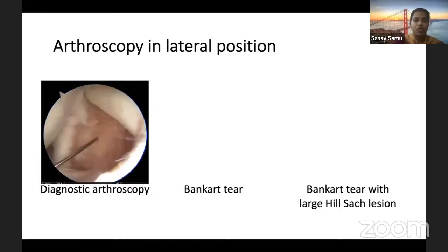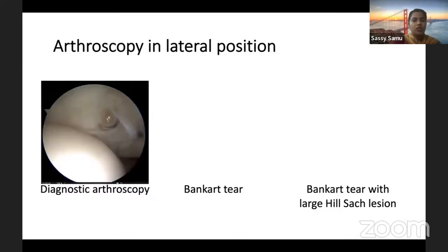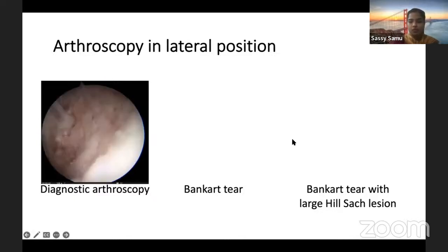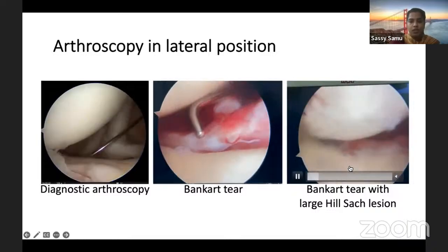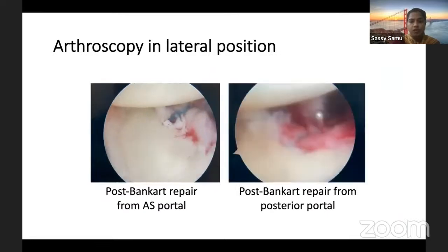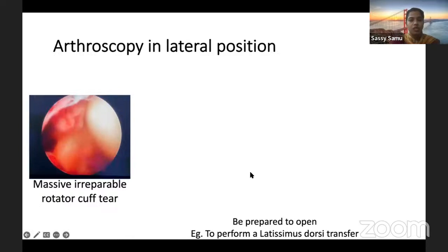you enter with an 18-gauge needle, and then as a beginner, you can start with having a portal with a cannula, and then you get to see the various structures. This is the rotator cuff, and posteriorly you have a large Hill-Sachs defect here. This is an example of an anterior Bankart tear, the large Hill-Sachs lesion. This is post-repair. This is an example of massive irreparable rotator cuff tear, which is visualized in a diagnostic arthroscopy.